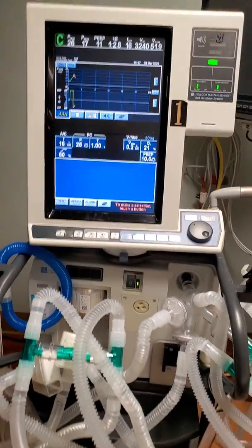Now, one more thing I'll add right now is that we did another thing where we were able to lengthen the tubes far more. And even when we lengthened the tubes, we did a pressure check on those, and with 20 feet of tube, the pressure and the volumes were not impacted. Which is pretty fascinating, that you can have a single ventilator which can go to different places, and we would be able to take care of the patient.